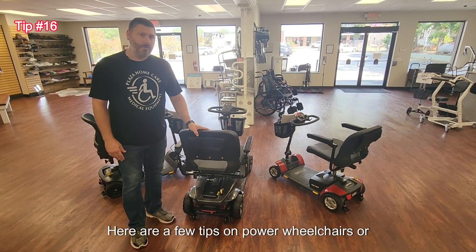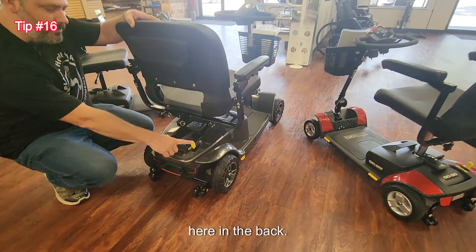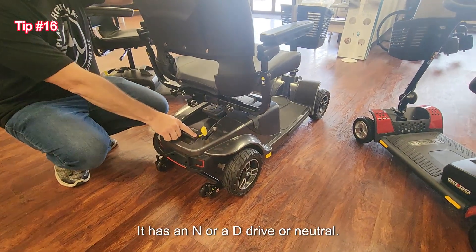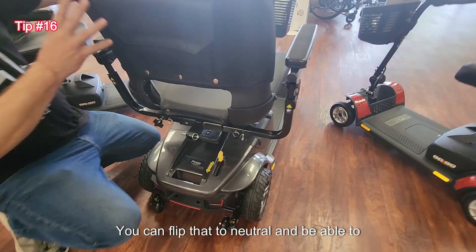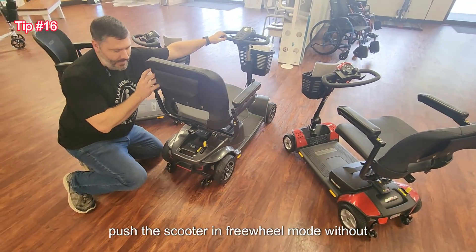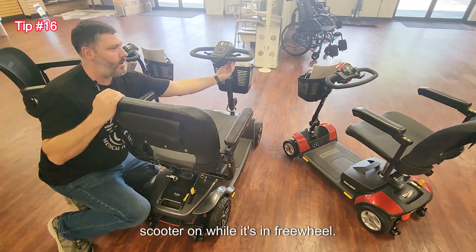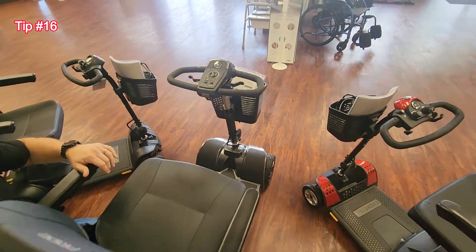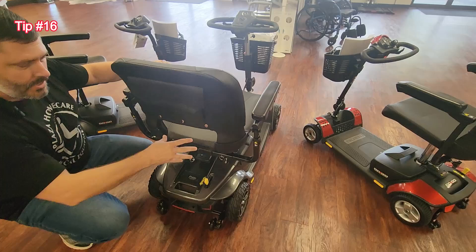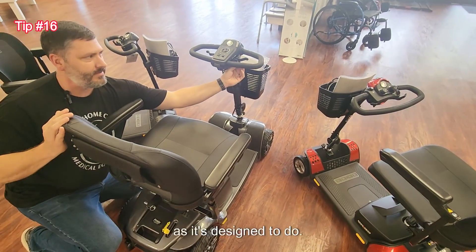Here are a few tips on power wheelchairs or scooters. Most are going to have a yellow latch in the back with an N or D — drive or neutral. You can flip that to neutral and be able to push the scooter in freewheel mode without it being on or operating. The trick here is if you turn the scooter on while it's in freewheel, it's going to let you know something's wrong. To correct that, just put it back in drive — you then cannot freely push it, and the scooter would then work as it's designed to do.